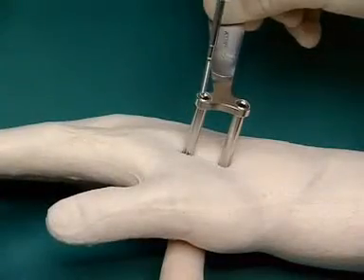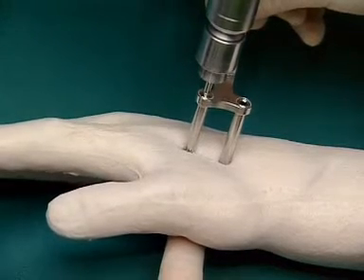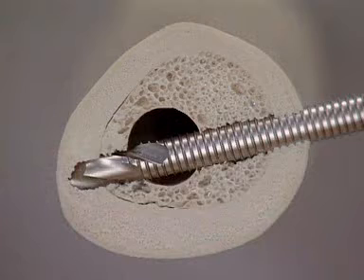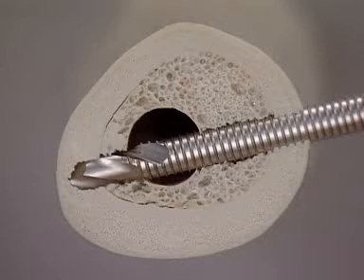Under image intensifier control, a self-drilling Schanz screw is inserted through the distal sleeve with the drill so that the tip finds purchase in the opposite cortex. Complete perforation of this cortex is not necessary. An atraumatic technique can be achieved by reducing both the penetration of the tip and the heat generated during the screwing-in process.